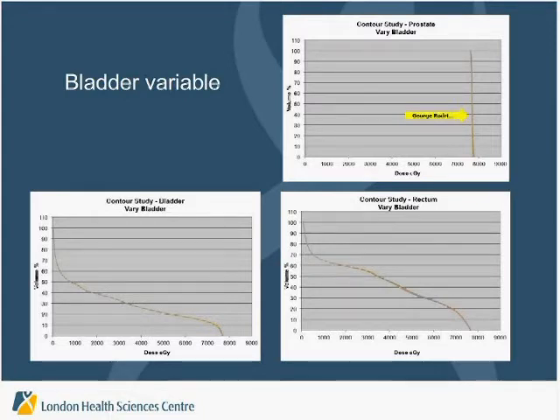So this actually has got us thinking about whether or not there is a hierarchy of contours. So in this simple system, and once again, this is all new for us, we think that based on the planning that was done and the contouring variation that exists, the amount of variation in the GTV is paramount. That drives your DVH differences with regards to the propagated DVH differences. Rectum, with its close proximity to the prostate, is in the middle. It's more of a moderate effect.